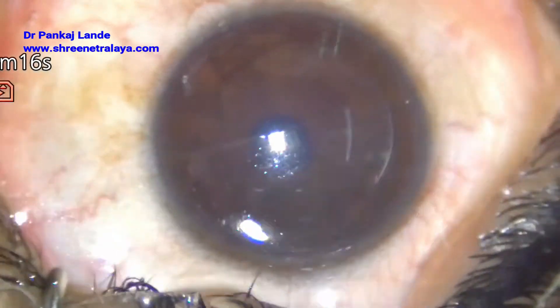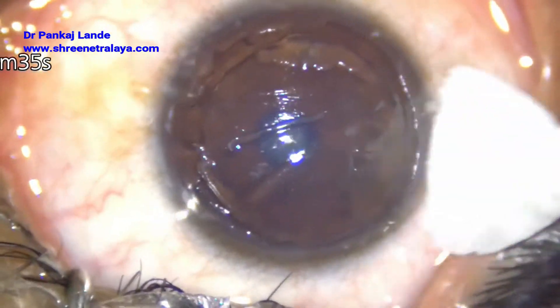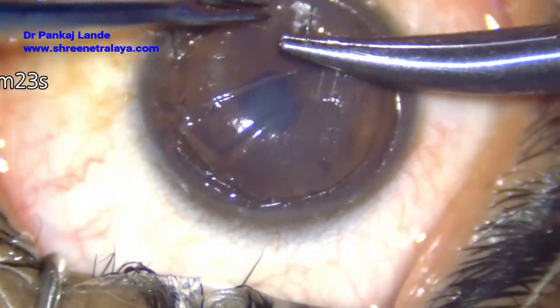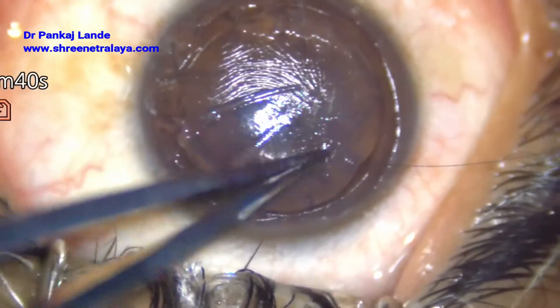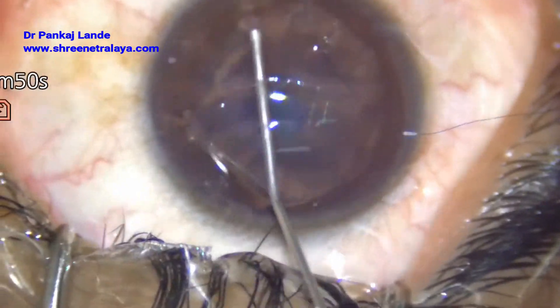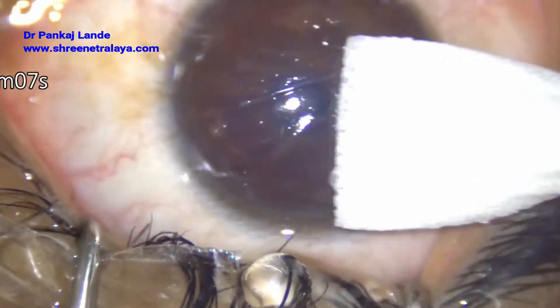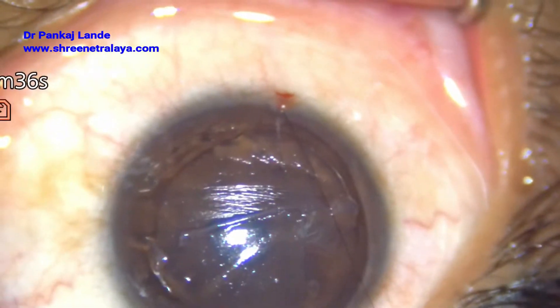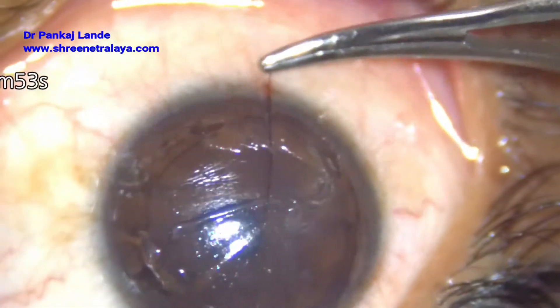While applying these sutures, take care that the length of suture is adequate and is not causing any undue pressure or pulling on the flap. Again, the suture knot should be buried away from the flap. You must apply the sutures in such a way to neutralize the striae on the flap and have a regular wrinkle-free flap on the table.